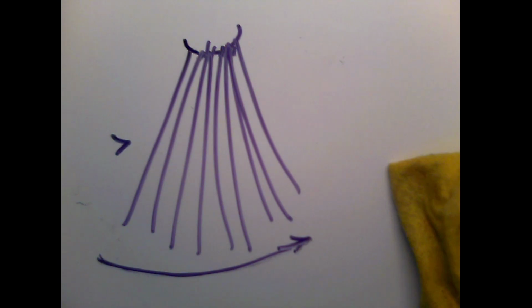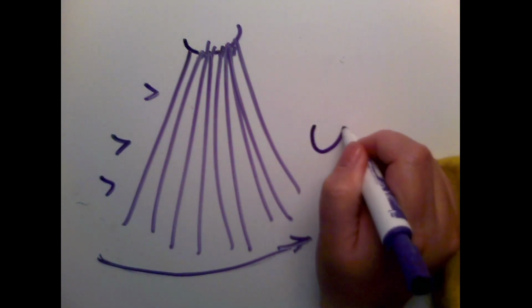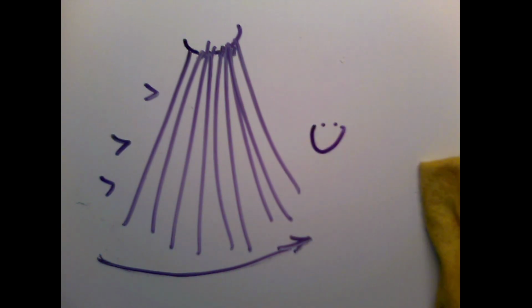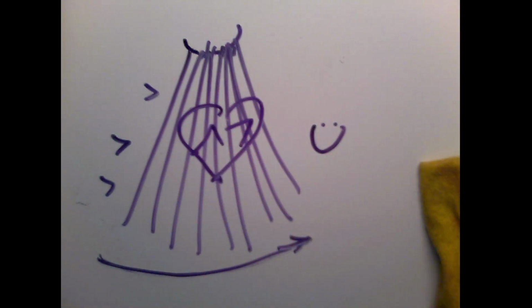So when you add foci in, you can get an awesome still picture. So maybe that's for your gallbladder, for your liver, for your thyroid. If you need to see something moving in here, if you need to see those valves moving in a heart, you got to get rid of some foci so we can see real-time imaging of those valves.